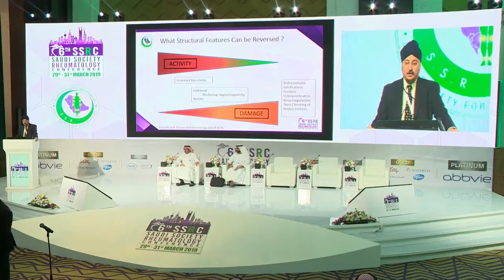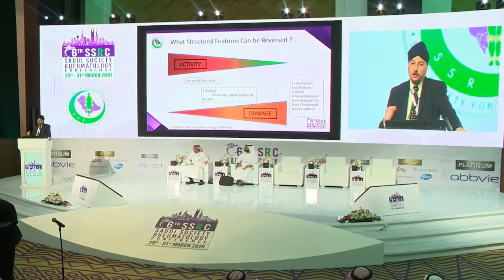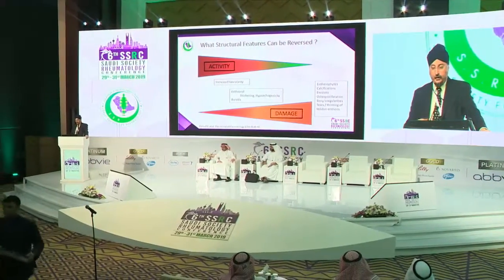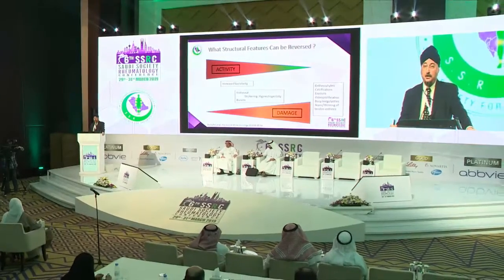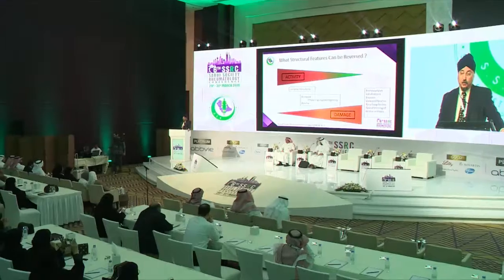So with ultrasound, what we are interested in is, again, what changes with treatment. So obviously, things like enthesiophytes, calcification, osteoproliferation, I think all of us can agree that this is damage. It's not going to change much in terms of regression. It might get worse a little bit, but you're not going to see much responsiveness there. So I think the lesions we're looking at, and the literature does agree, is really neovascularity as well as enthesial thickening and hypoechogenicity and bursitis. And this is where most of the literature agrees.